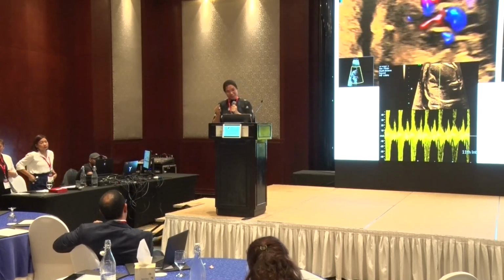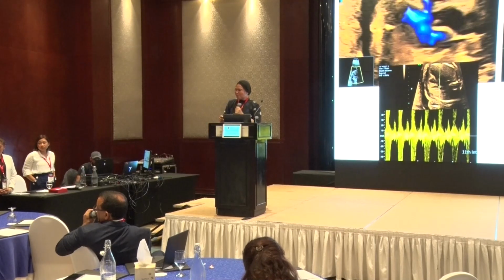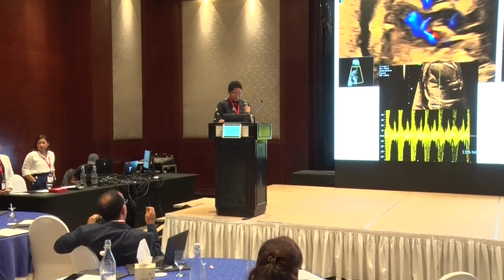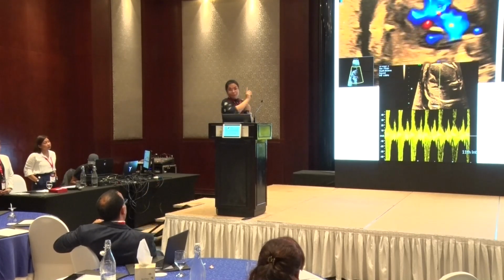The second one? Yeah. What do you think, Dr. Diana? Did you review? We were looking at the images before. I think from this view, with that small valve, it looks like we have completely two separate valves. But the other one doesn't have a clear valve.